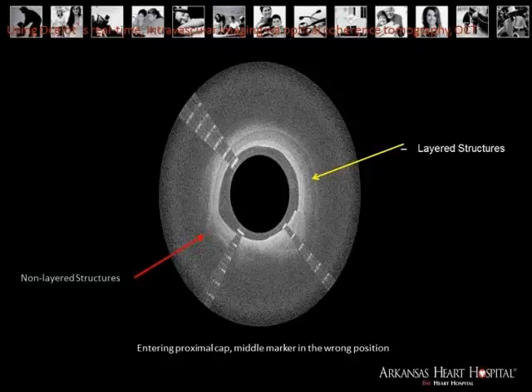After those, we would then also look for cat ears, which we've mentioned previously would be the tearing of the atheroma. Having the cat ears point away from you would also indicate that your positioning is well for you to advance the catheter.